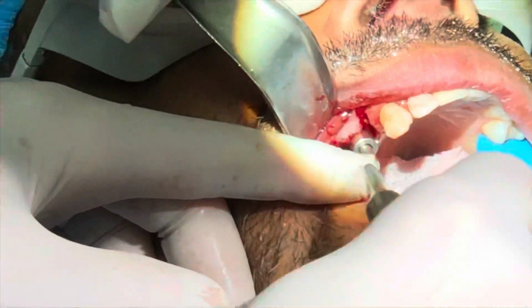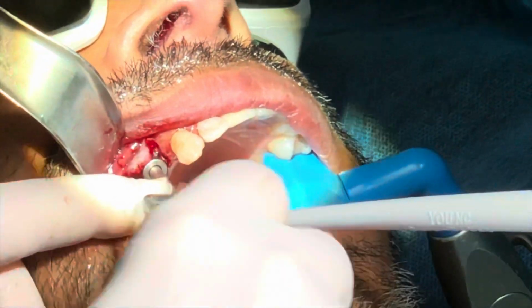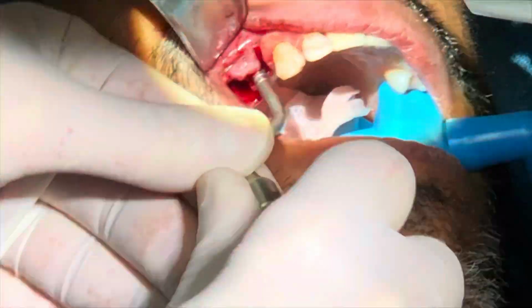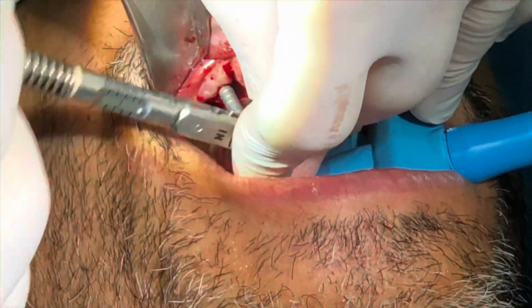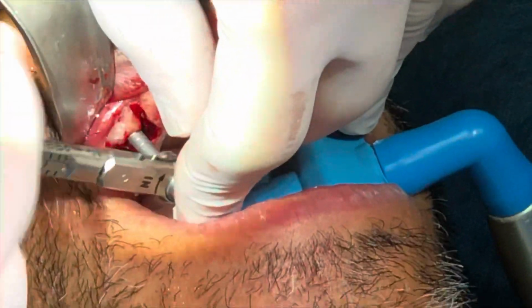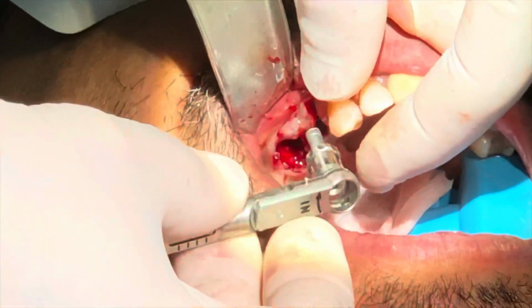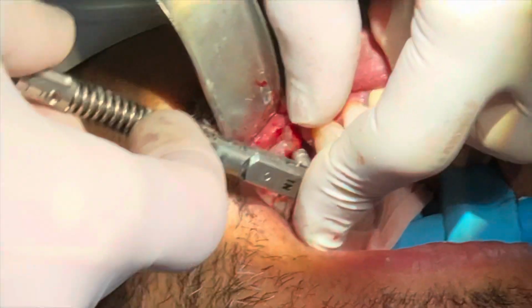I have enough depth, but I don't have as much thickness as I want, so I will stretch the bone a little bit for the next 3 sizes rather than drilling out the bone. I'd rather keep some bone and stretch it. And this is the final tapping from the Zeramex system. I tap all the way to the apex of the implant.